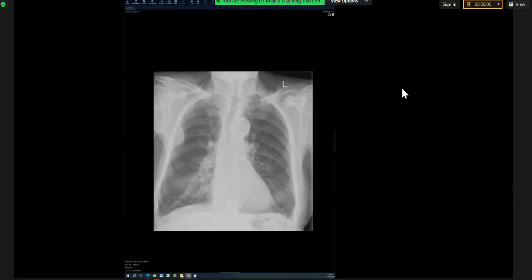Isn't myeloma plasmacytoma a purely lytic lesion? Why does it appear soft tissue density in the final case? A lytic lesion is something that destroys the bone. When bone is destroyed, it doesn't result in air or fat. It looks like soft tissue. So it doesn't calcify, it's just the bone expands and it can look like soft tissue.